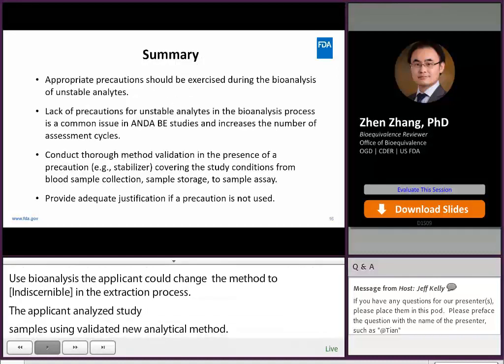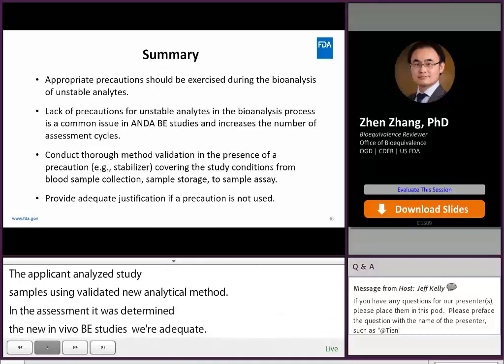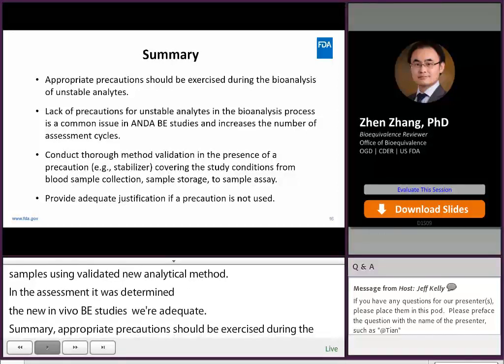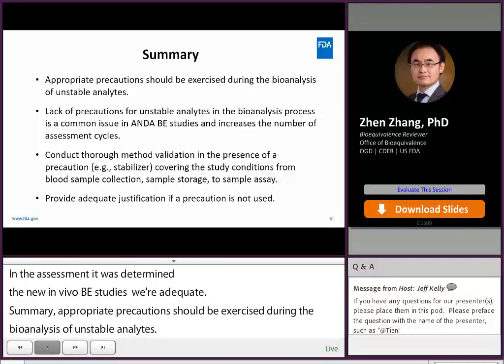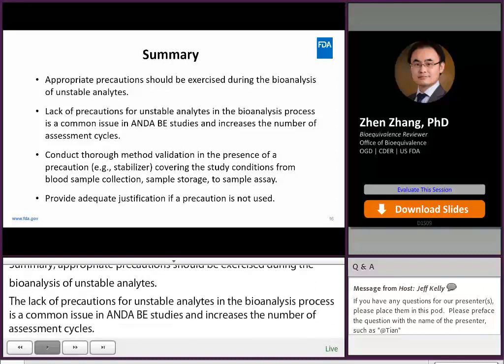In summary, appropriate precautions should be exercised during the bioanalysis of unstable analytes. Lack of precautions for unstable analytes in the bioanalysis process is a common issue in ANDA BE studies and increases the number of assessment cycles. If the analyte is unstable, the applicant should conduct a thorough method validation in the presence of a precaution, covering the study conditions from blood sample collection, sample storage, to sample assay. The applicant also needs to provide adequate justification if a precaution is not used.